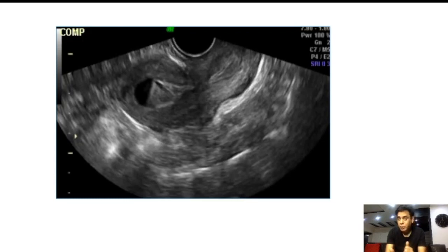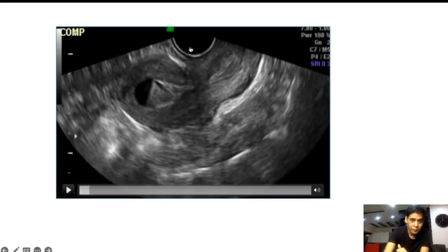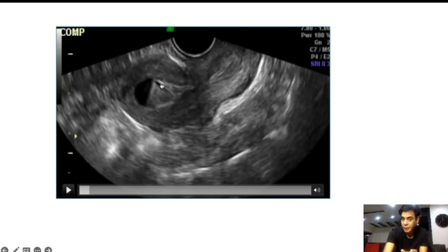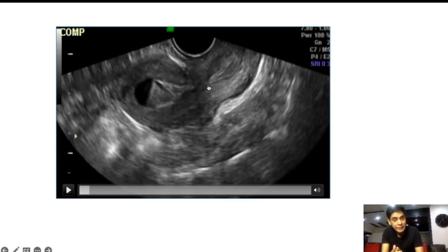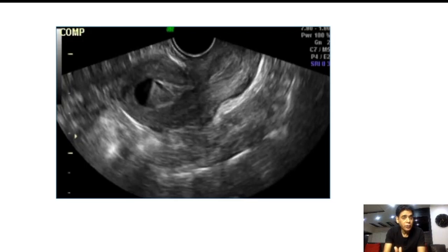The common cause of internal echoes within the uterine cavity is of course blood, followed by pus. So let us consider first the blood part. Here you can make out that there is fluid collection in the uterine cavity, and this fluid collection has probably a blood component. This has a level, meaning two different densities of fluid. Whenever such a collection is present in the uterine cavity, we should always try to look close to the internal os, because this is the level where the majority of causes of obstruction are found.